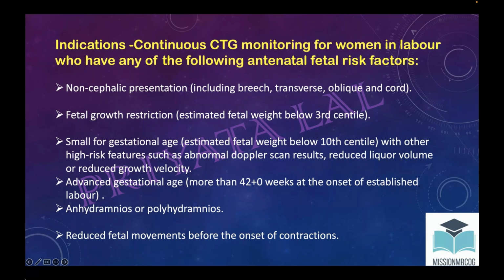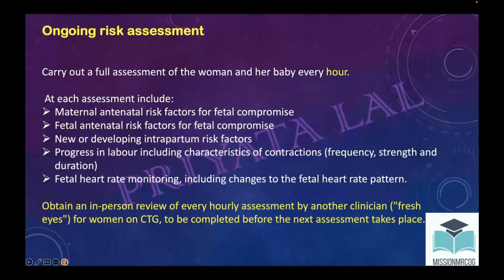Now, whenever the patient is coming or any risk factor is there, we have to do an overall assessment again: maternal risk factor, fetal risk factor, and any new risk factor that is developing in the intrapartum. What are the contractions? Fetal heart monitoring along with the contractions.